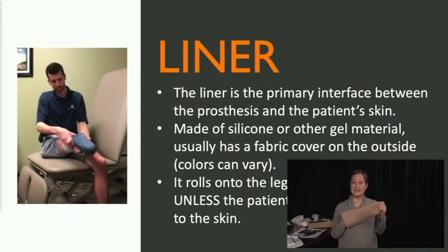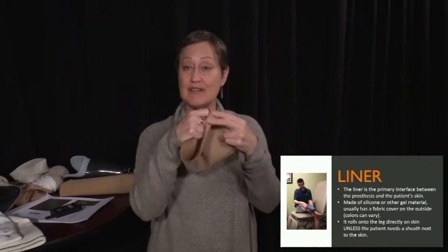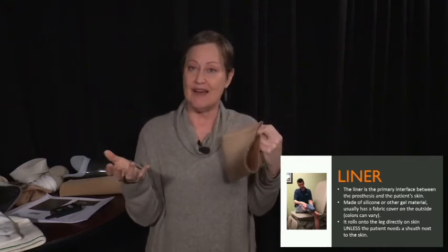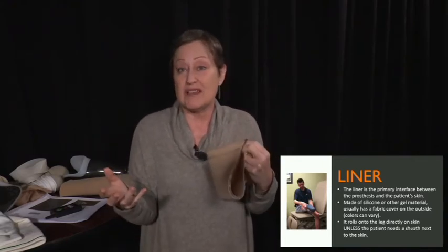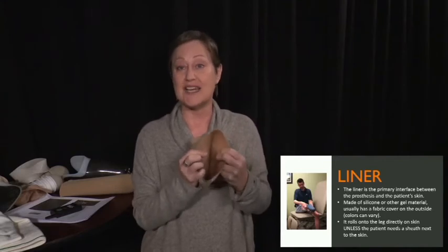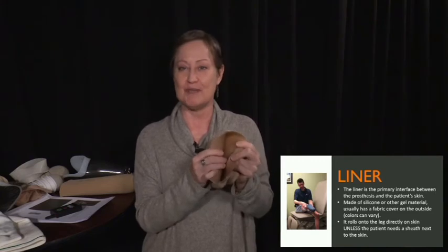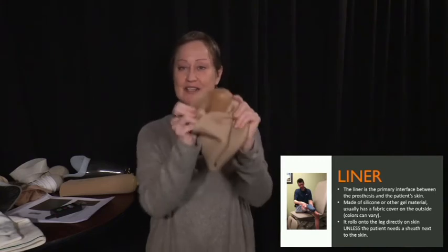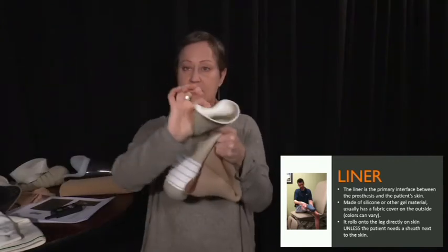All right, moving on to liners. So the liners are the primary interface between the patient's skin and the socket. So this is kind of where the action happens. There are lots of different kinds of liners. I didn't realize that for a long time. I thought, oh, there's a couple out there, and I didn't know what would make a prosthetist choose one over another. I'm understanding that better now. But as a therapist, don't worry about it too much. Just trust that the prosthetist is going to choose correctly. So some of them have gel on the inside of them. Some of them are lined with silicone.